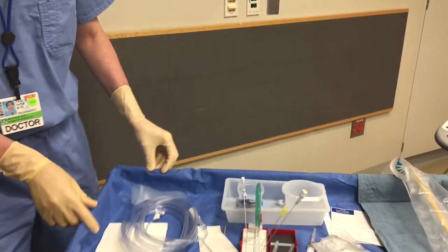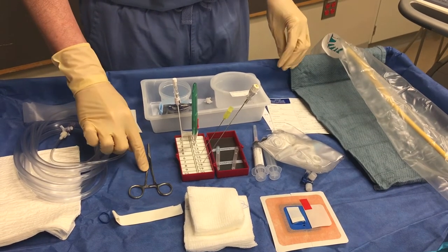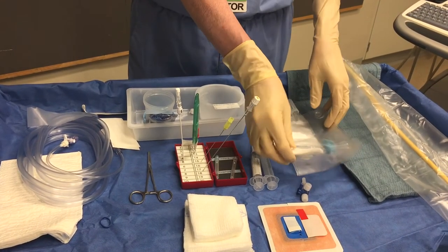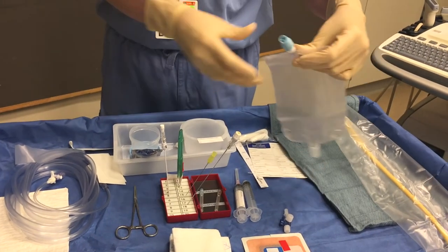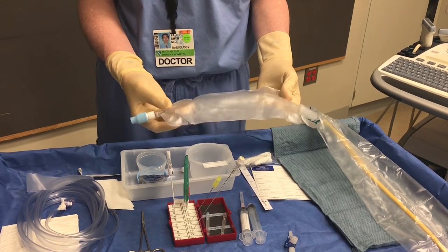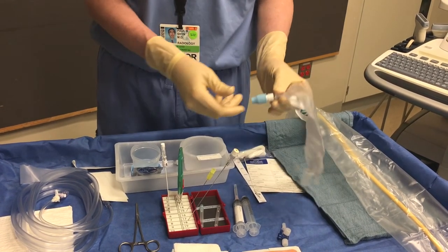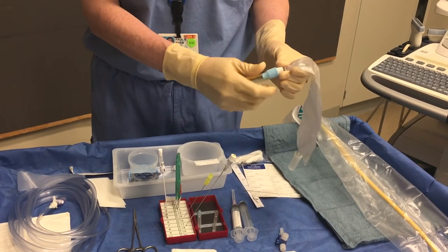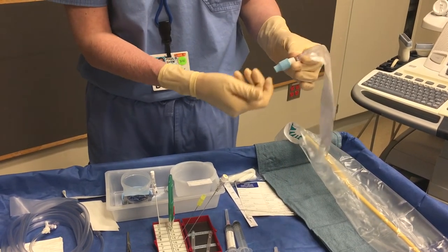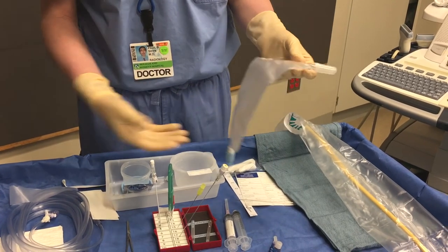We have Steri-Strips if needed, and the tissue spreaders can also be used as a needle driver. For catheter drainage, a drainage bag may be on the table. It's packaged clean, not sterile, so often we ask that it be handed to us at the end of the procedure. When you have the drainage bag, first tighten the bottom valve so it doesn't leak once filling with drainage. This valve is what nurses open to empty the bag — just make sure it's closed before attaching to the patient.